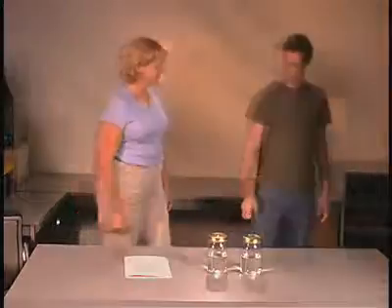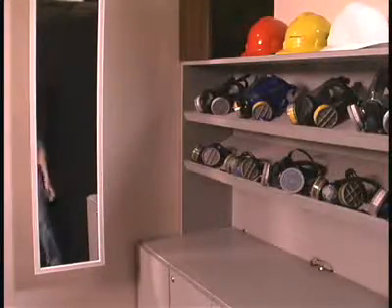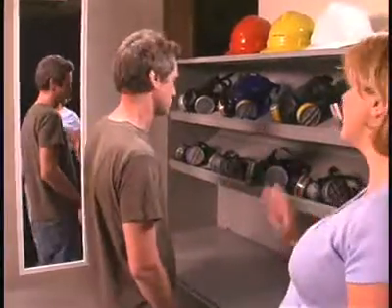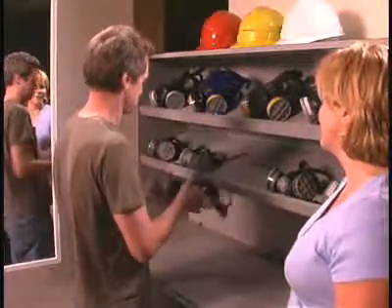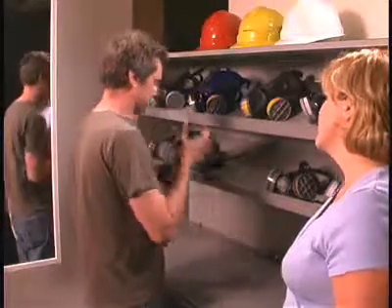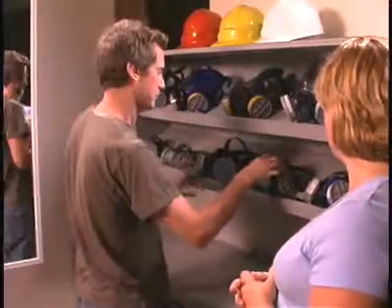Conduct the selection process in a room separate from the fit test chamber to prevent odor fatigue. Provide a mirror to assist the subject in positioning the respirator and evaluating the fit. Have the test subject select the most comfortable respirator from a sufficient number of respirator models and sizes so that the respirator is acceptable and fits correctly. The subject must perform all donning and adjustments to the facepiece without assistance.